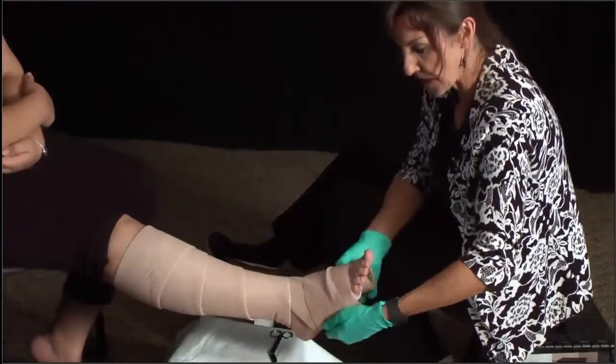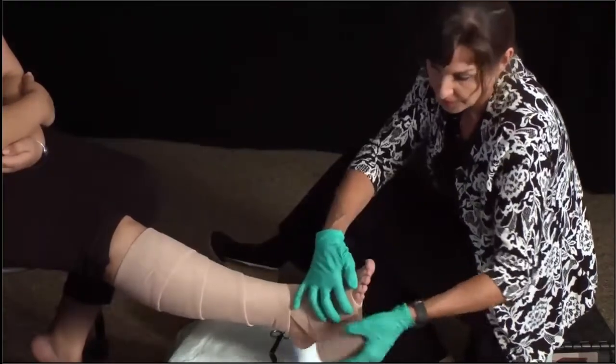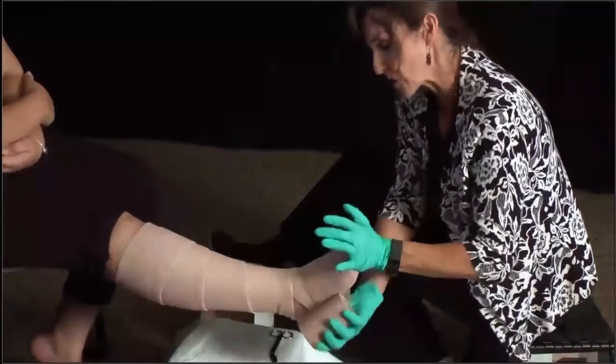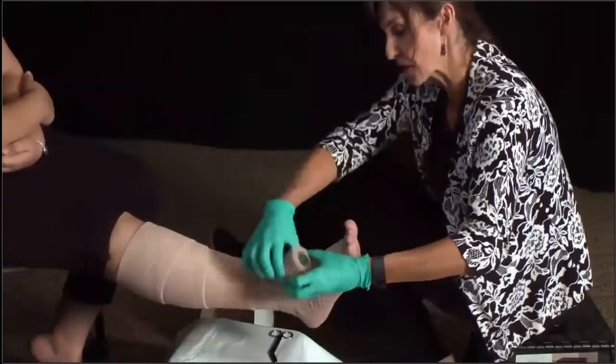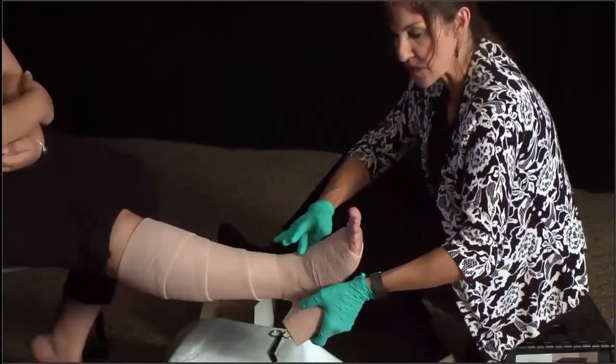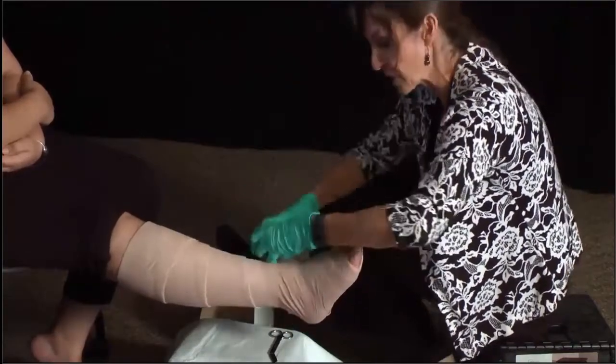Same thing — we are starting at the base of the toes, going around in a 50% spiral overlap. We'll just have her flex her heel. When you are applying these, it is important to try to get the patient to flex so they don't end up with excess pressure at this point, here on the top of the foot.